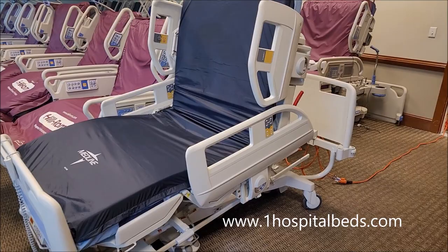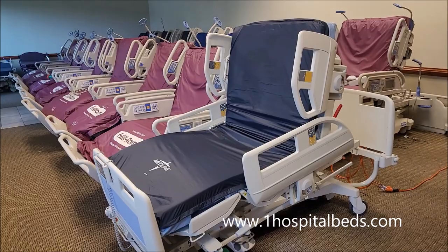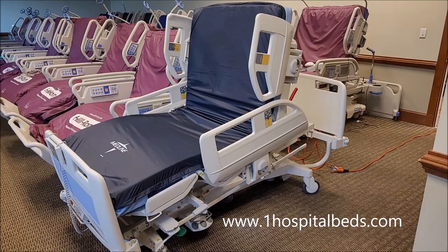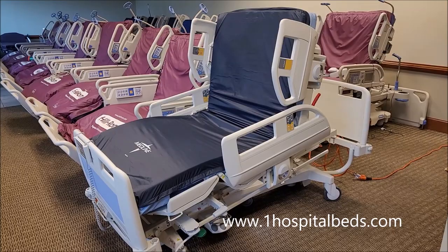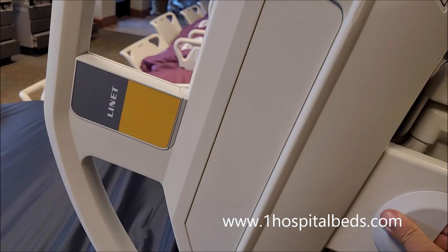basically is going to be power up and down, power head, power foot. And then you've got the Trendelenburg and the reverse Trendelenburg, which basically, I'll show you the buttons, but it tips the bed up and down. Feet up, if you have swelling of the feet, you want to recirculate some of the blood, get that back in the body. So you have the foot above the head, and you have the head above the feet with a lot of cardiac-related issues, where normally they want the person that has cardiac issues at least 30 degrees above the head area above them. So this bed obviously can do that very easily, very easy to drop down rails. You've got these little buttons right here that just pop right out.